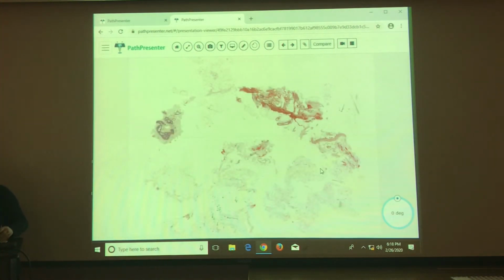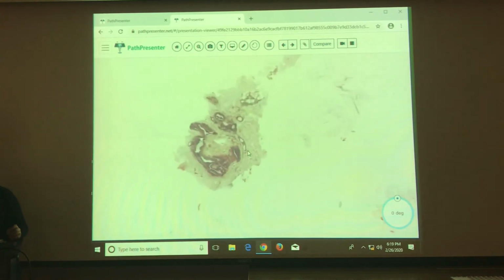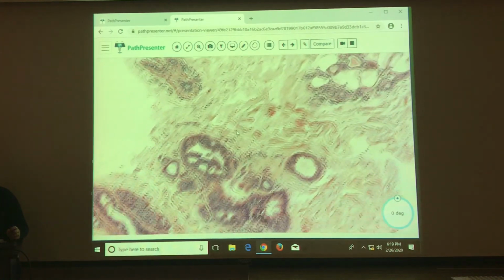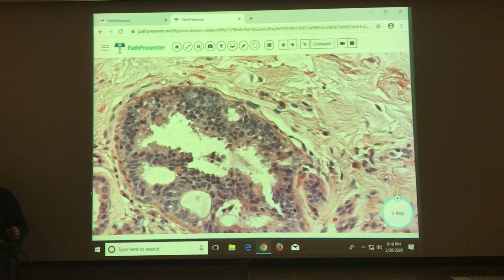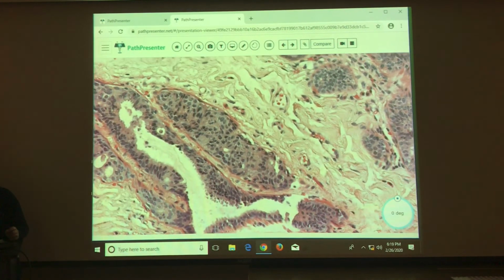All right. Again, breast tissue. This one's mostly fatty. We have some population of ducts here, which we'll take a better look at. Seems to be not really any ducts here. So let's take a look. So there is a proliferation just looking at this. The lesions, at this power, look a little punched out. Kind of smooth borders, not really jagged. This one maybe you could argue is a little more jagged.